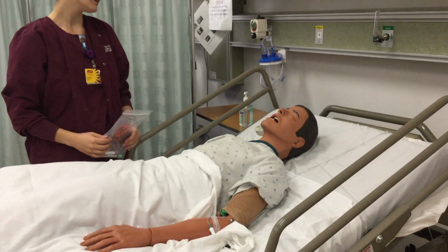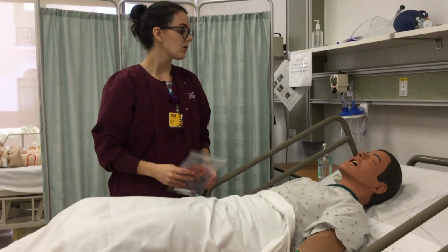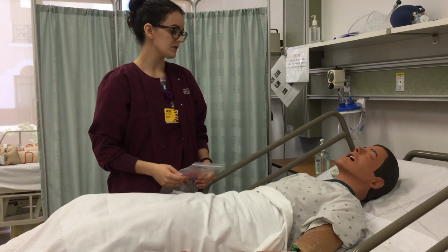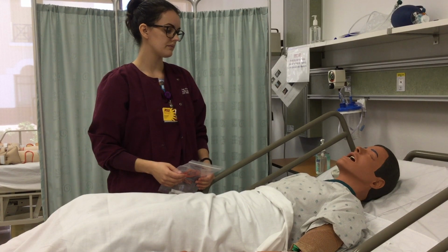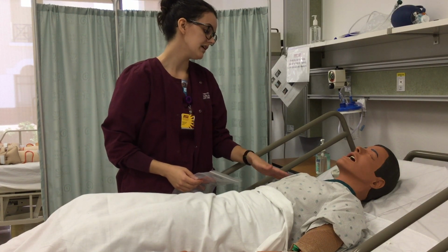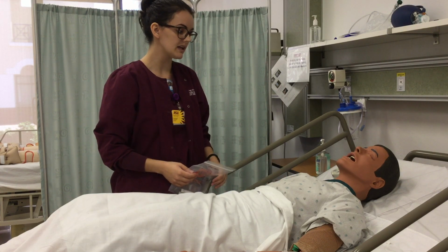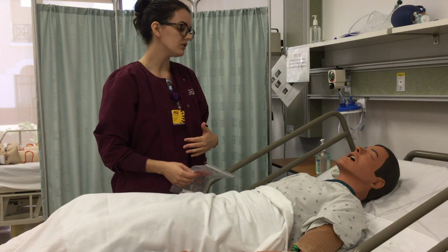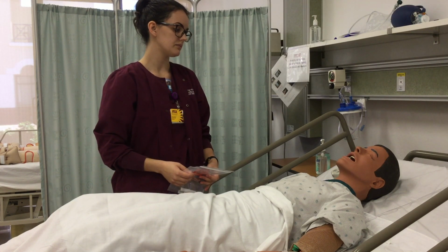And all done, Mr. Chester. Are you feeling okay? Yes, I feel fine. Good. I'm going to take these to the lab. Do you have any questions for me? No, thank you. Provide your patient with post-procedure education. I do want you to keep an eye on your insertion site. If you start to feel any pain, swelling, or you see any redness, I do want you to give me a call. Use your call light, please. All of those are signs of infection. Will do. Thank you very much.